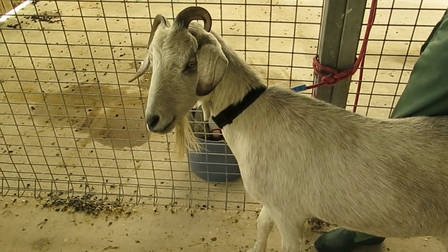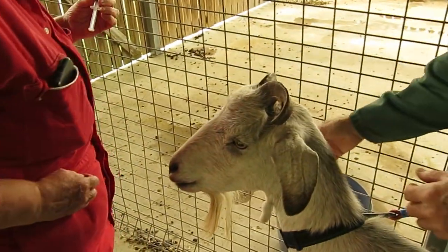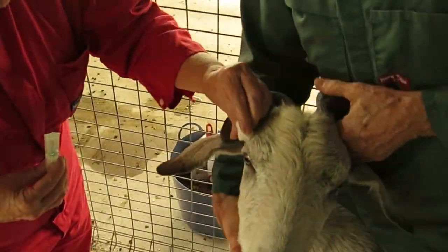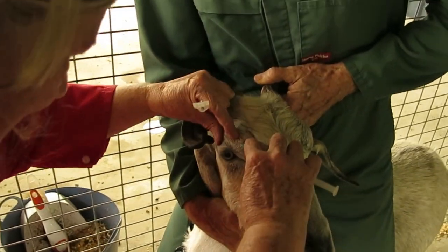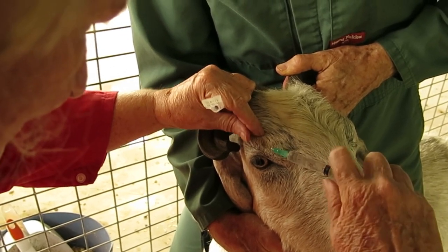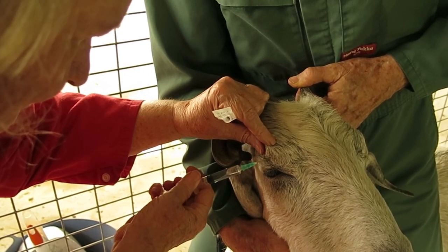The goat is well restrained. Now it's getting the two local blocks per side. The first block is the infratrochlear nerve, getting 1 ml just under the skin. Drawing back to make sure I'm not in a blood vessel, then injecting 1 ml.